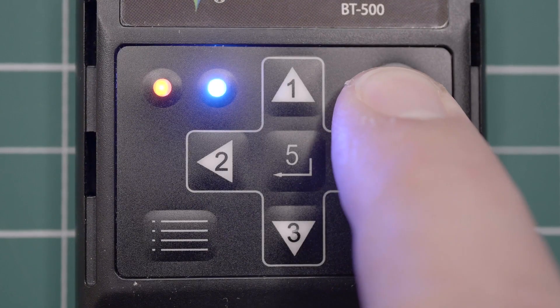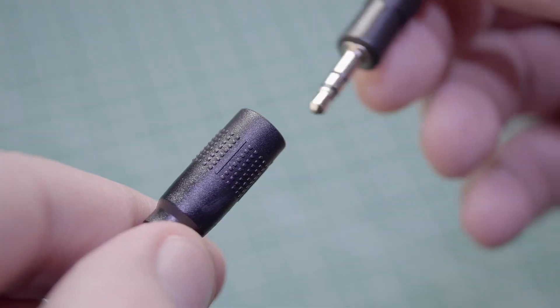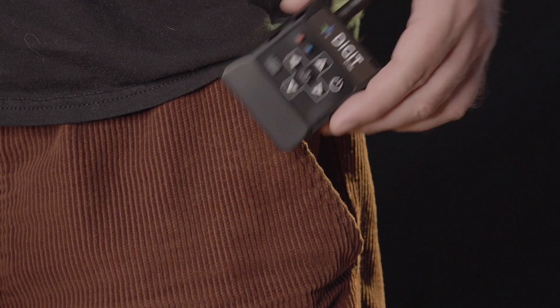Power on the Digit 500 remote, connect to your device, and you're ready to go. The ByteSwitch remote controller bundle comes with a 6 foot extender cable. Mount the Digit into headgear or put it into your pocket.